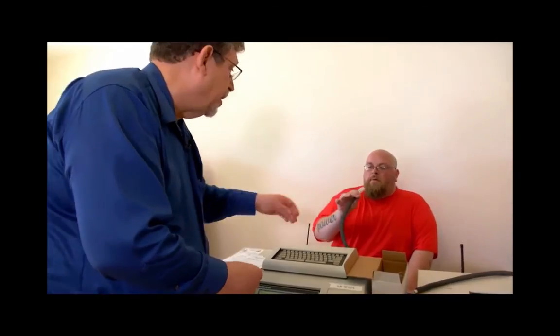Take another look here. This is control. Okay, give a nice long steady blow.